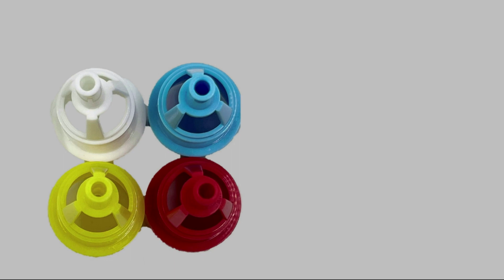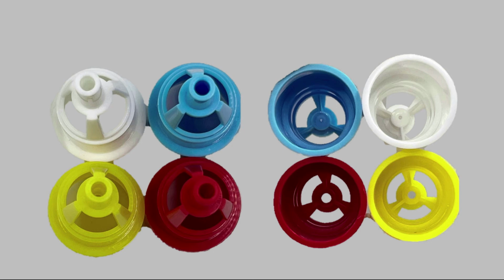If you look carefully at the top of these devices, they all kind of look similar, don't they? But they're not. And if you turn the device over and look at the inside, you'll see that there is a difference that may not be easily apparent. Let's start looking at the red one there, the 40%, and I'm just going to put a little arrow on here. This is the injector port for this device, and you can see that you can look all the way through it. It's a pretty big hole. Compare that with the 24% device, the blue one, and it's barely a pinprick. It's really, really small. And that's because that's how it's designed.